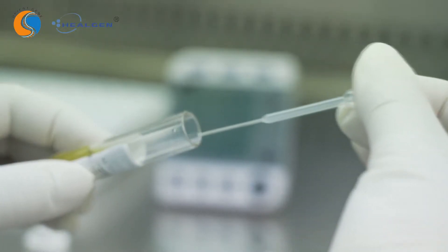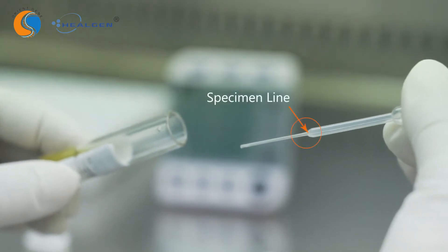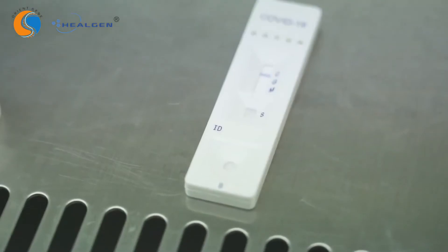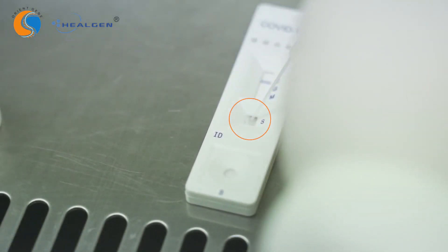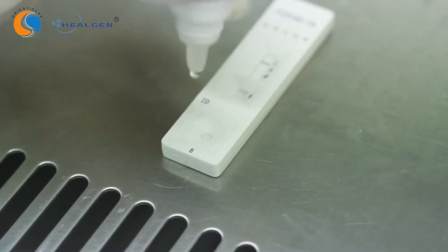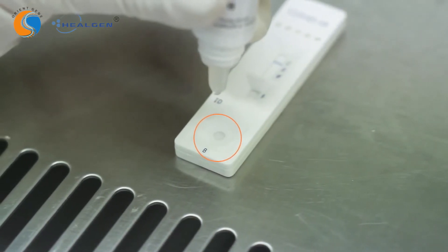When using a disposable dropper for serum or plasma specimen, draw a specimen until it reaches the specimen line. Hold the dropper vertically and transfer one drop of drawn specimen into the sample well labeled S on the test cassette. Then add two drops of buffer to the buffer well labeled B immediately after.